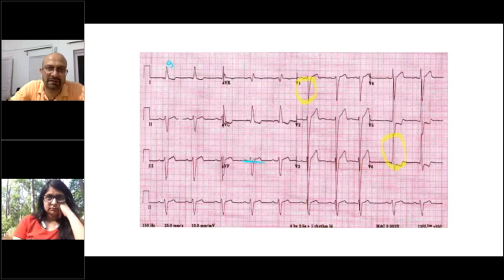Most predominantly, this is a negative complex, and this one was a positive complex. This entire thing was positive in lead 1, and this is negative in AVF. Let's calculate how much negative. We have about 3 squares up, 3 down, 5 and 5, 10. So we have about 13 negative squares and let's say about 3 or 4 positive squares.